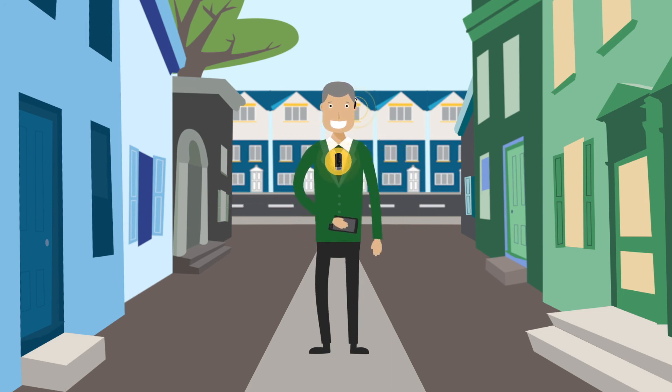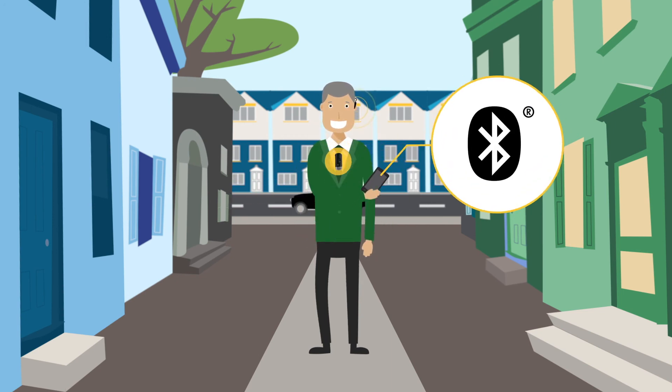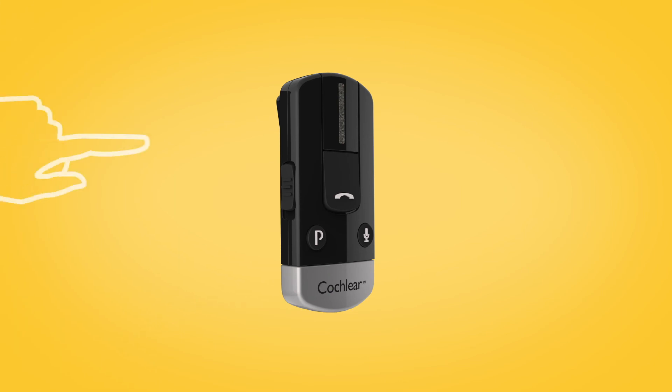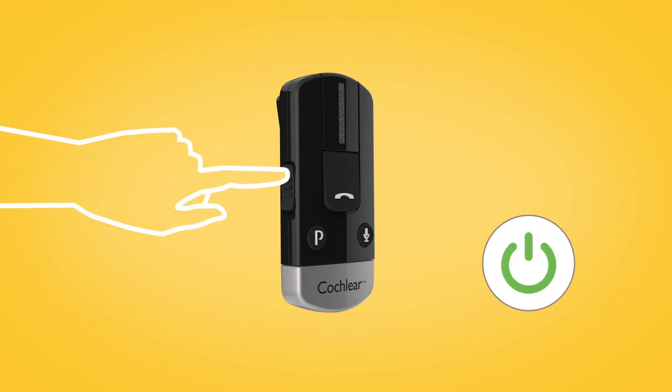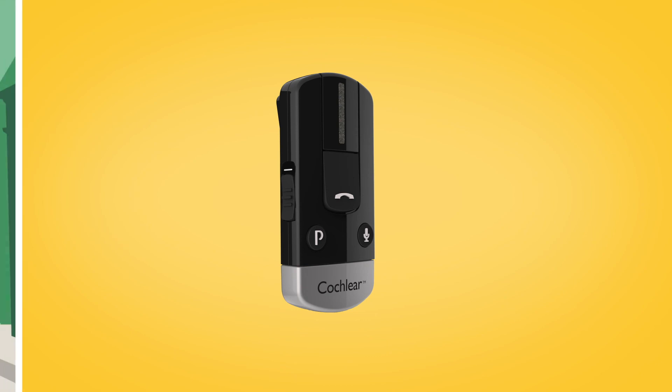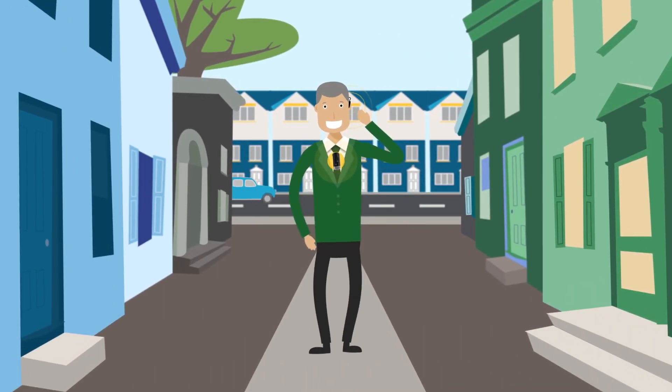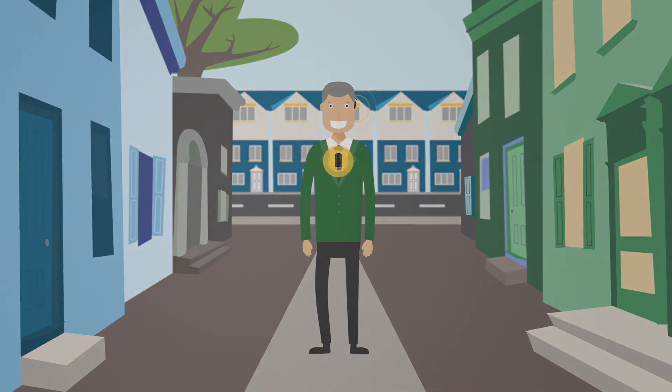If your mobile phone asks which Bluetooth service you wish to enable, select Headset. To start streaming audio, simply turn on your phone clip. When audio starts playing from your Bluetooth-enabled device, it will automatically stream audio to your sound processor.